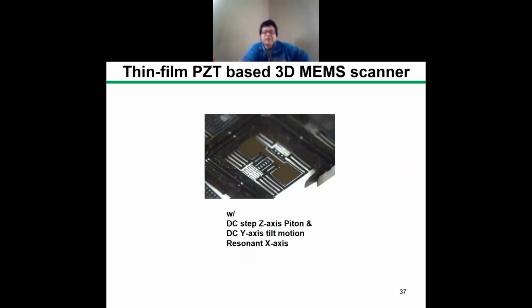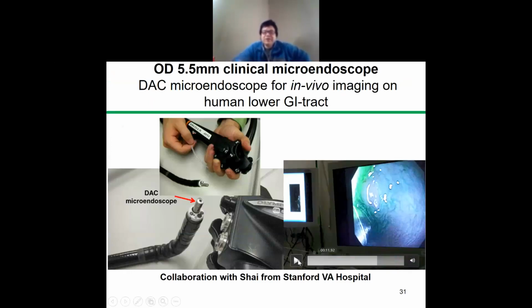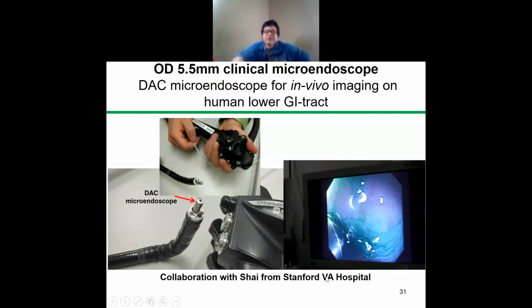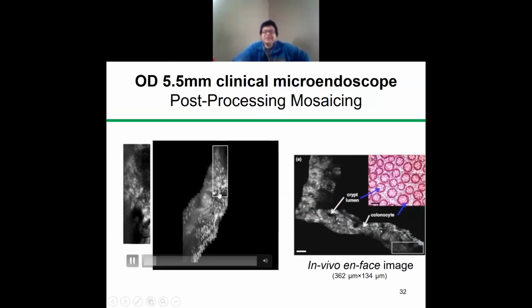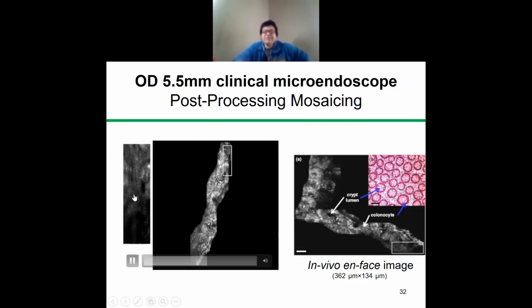Let's take a very simple example. We did it before. So maybe here, this is the image. Can you see the frame? Yes, right. Okay, this is a frame, each frame we took when imaging the tissue. On this frame, you can barely see anything with your eye. But with the mosaicing, you can tell this is a colon. Each frame is kind of fuzzy. This is a real case: each frame has lower resolution and a lot of motion.